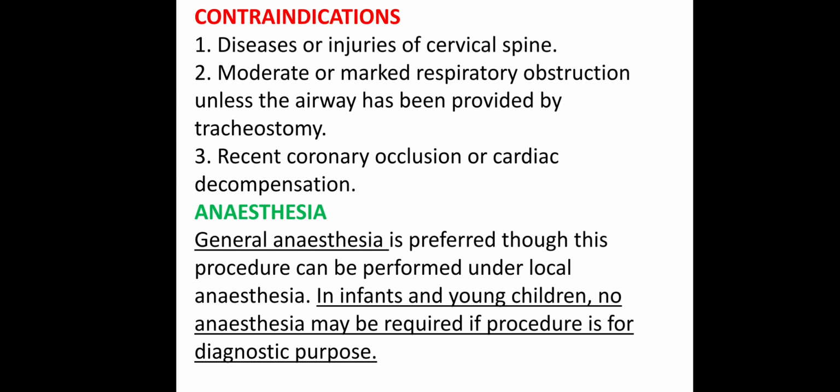Contraindications: diseases or injuries of the cervical spine, moderate or marked respiratory obstruction unless the airway has been provided by tracheostomy, recent coronary occlusion and cardiac decompensation. Anesthesia: general anesthesia is preferred, though this procedure can be performed under local anesthesia. In infants and young children, no anesthesia may be required if the procedure is for diagnostic purposes.